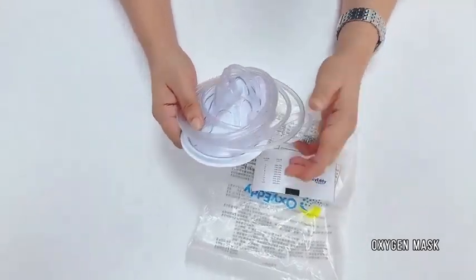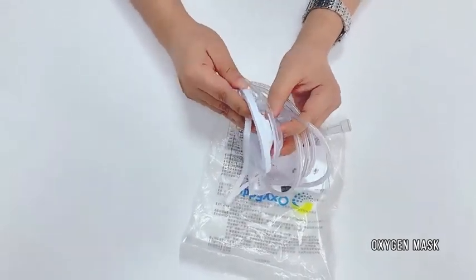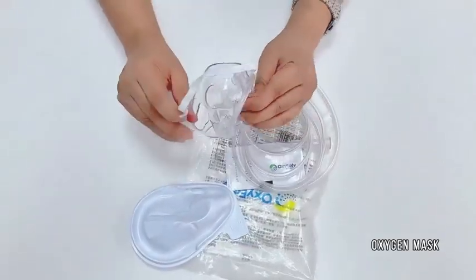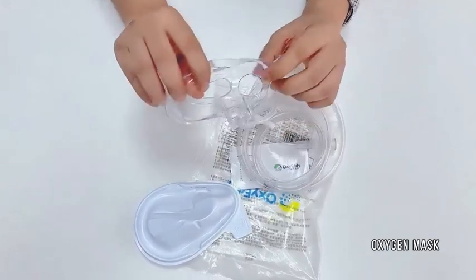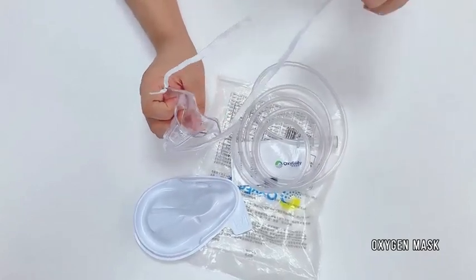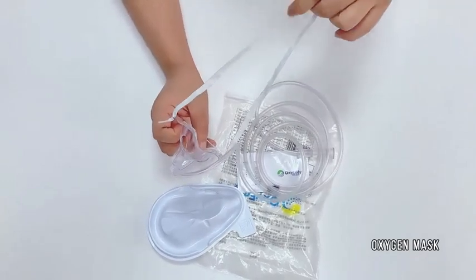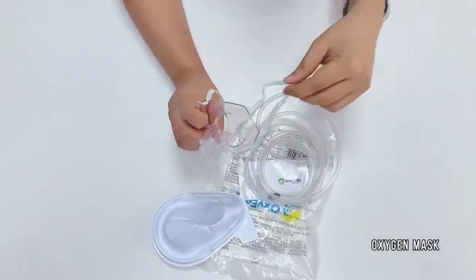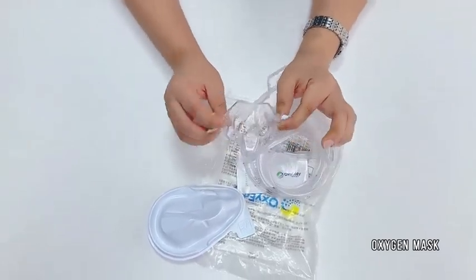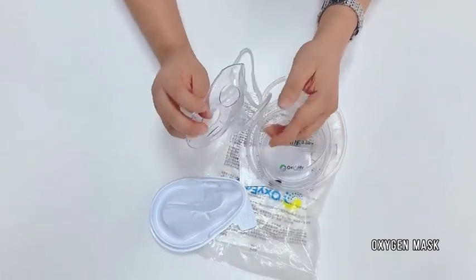Here is the OxyED mask. There is one elastic rubber band, so any patient can adjust and fit it with their face. It is very soft, light, and also very crystal clear.